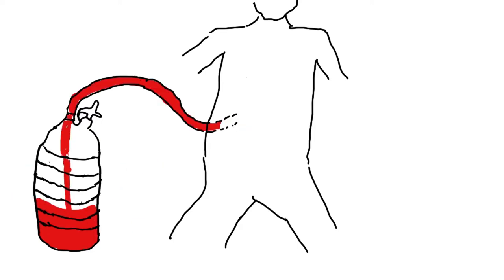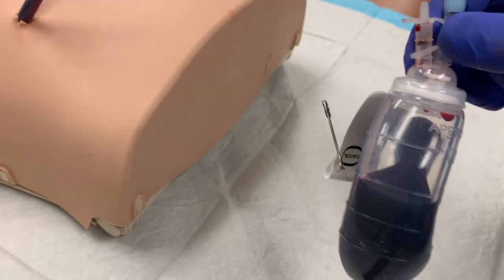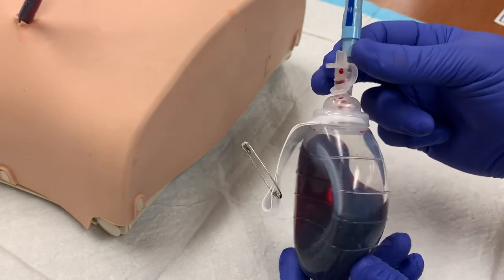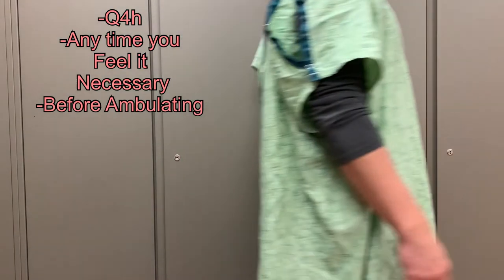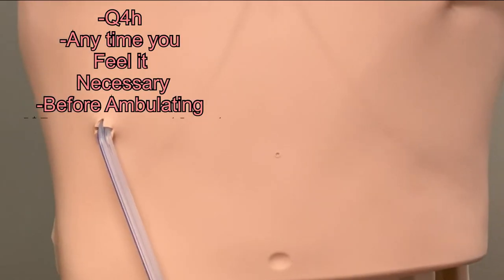If the bulb pulls enough drainage that it is able to return to its resting shape, there is no longer any negative pressure on the drainage system, and fluid will continue to accumulate in the operative site. As the bulb fills, you will need to empty it periodically. This should be done at a minimum every four hours, but it can be done at any point you find it necessary. If the patient is going to ambulate, the drain should be emptied so that its weight won't accidentally cause the tube to be pulled out of place.